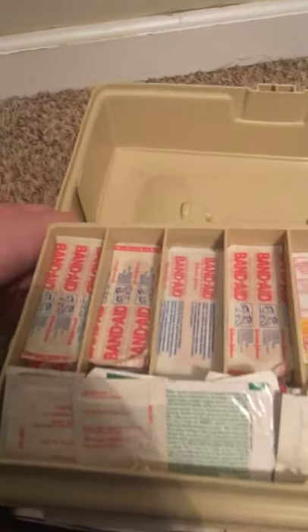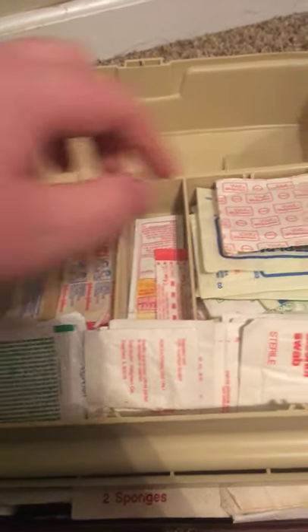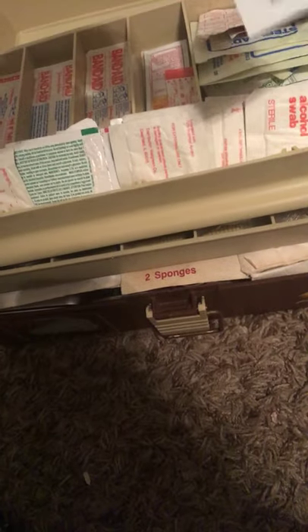As you can see on top, we have some bandages. I have a little package of sunscreen, assorted bandages, gauze pads, moist towelettes. And right here I have some more alcohol swabs, sting pads, and alcohol pads.